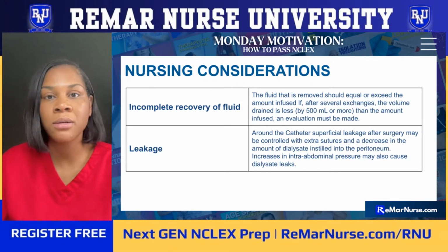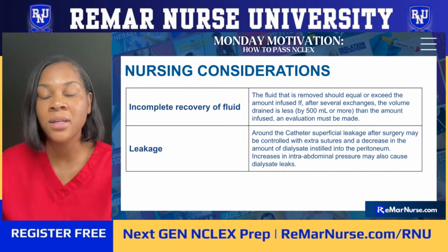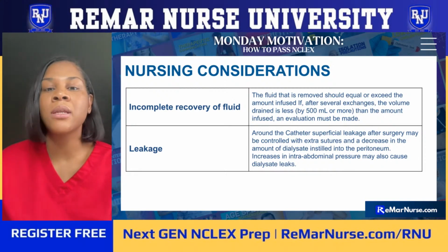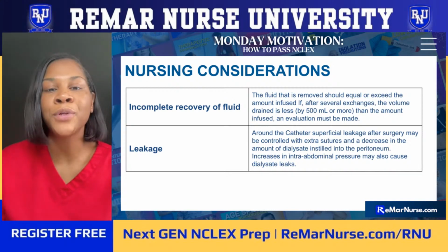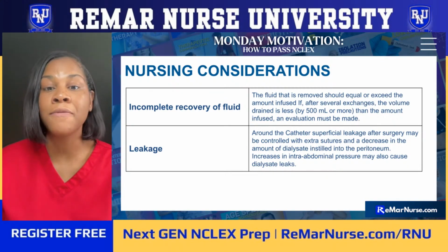Our nursing considerations, the complications are, of course, this: if all of the fluid that has been instilled cannot be removed. So an incomplete recovery of fluid. And I have here for my readers, the fluid that is removed should equal or exceed the amount infused.